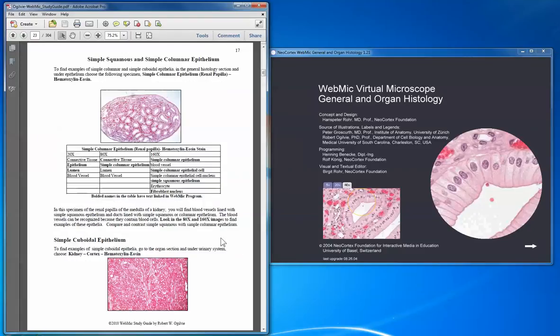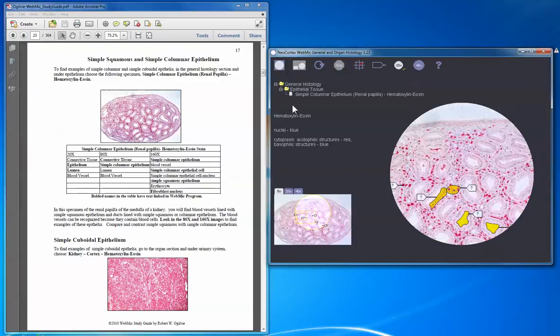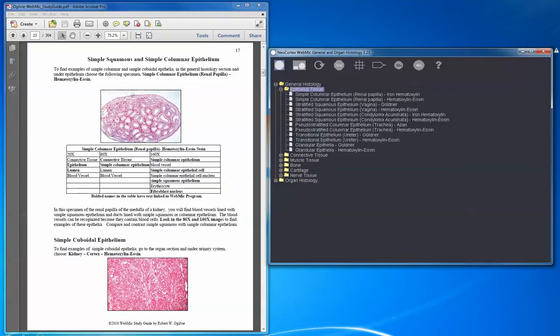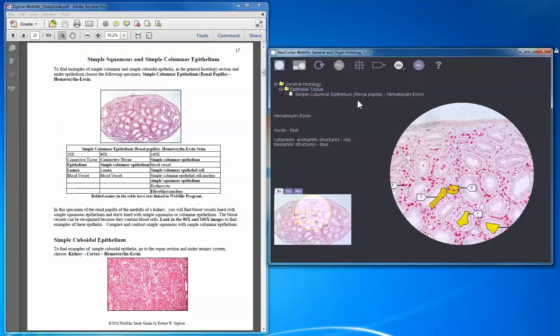You always have an overview and a list of what you should be able to identify once you complete the unit. Then on page 17, the first page of the epithelium unit in the WebMIC study guide, you're referred to a specific specimen. In this case, you're referred to the general histology section under epithelium. I'll click on the entry page, reduce it to those two folders, go to general histology, open up the epithelium folder, and find the specimen called simple columnar epithelium renal papilla. You can verify you're looking at the same image by seeing the thumbnail in the study guide.